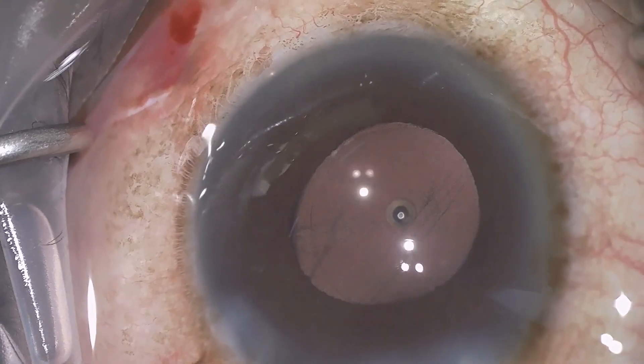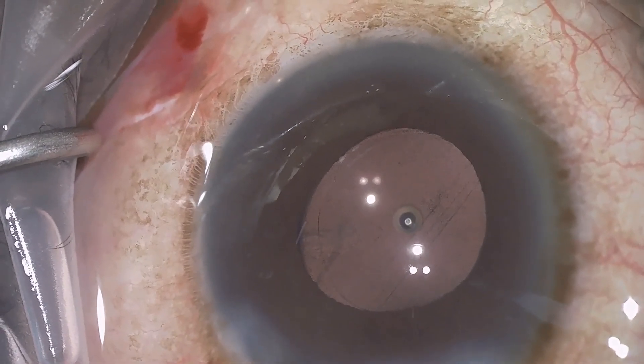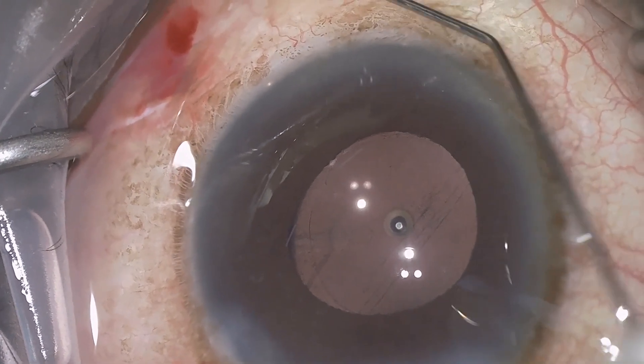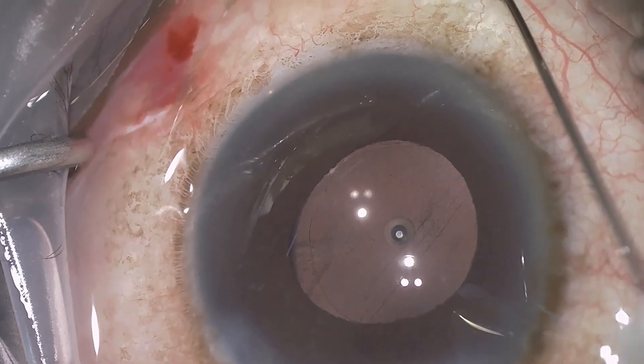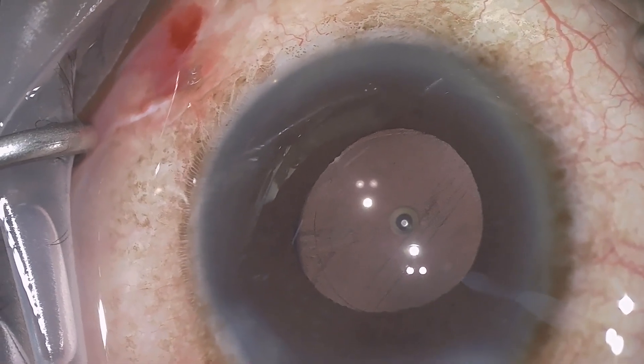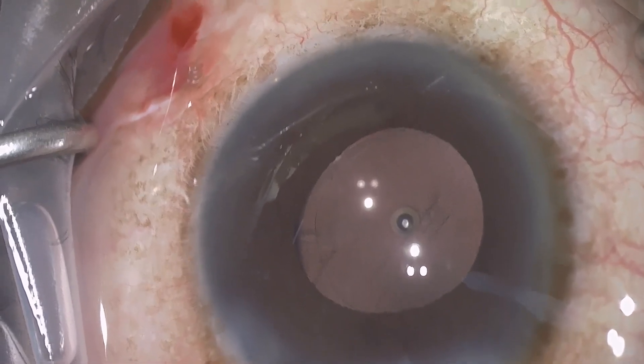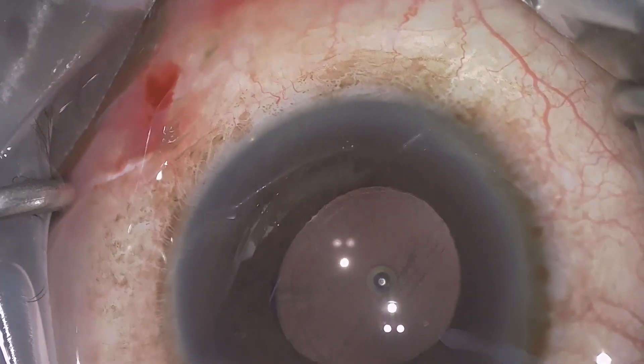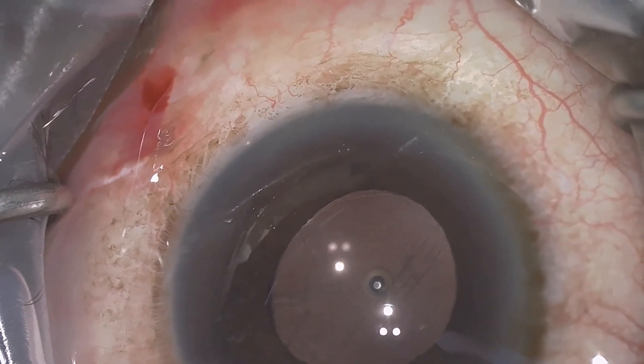So this is the stent that was in the area of relative angle pallor. And we can see that distal outflow has blanched very well. I hope these tips and tricks have been helpful. Thank you very much for your attention.